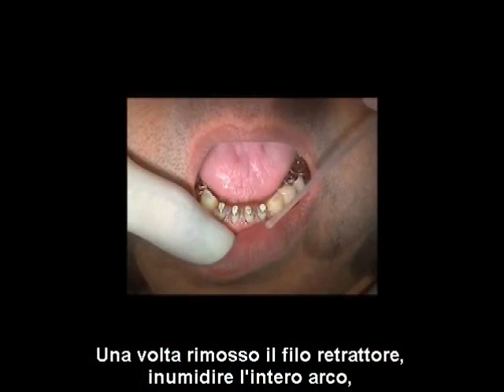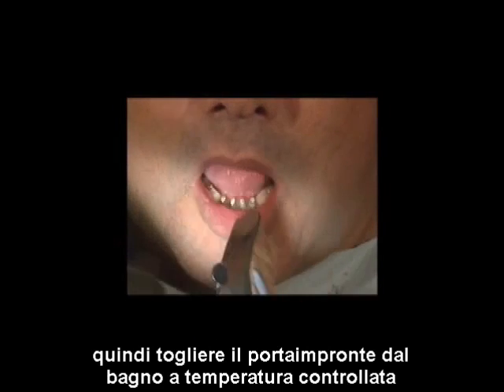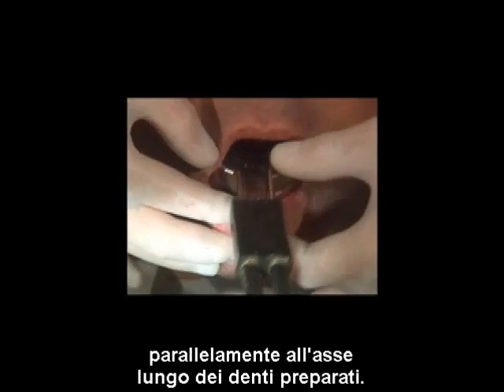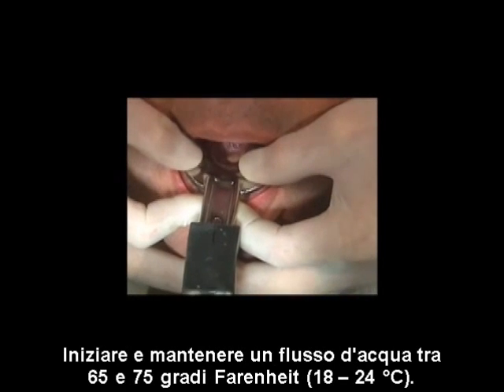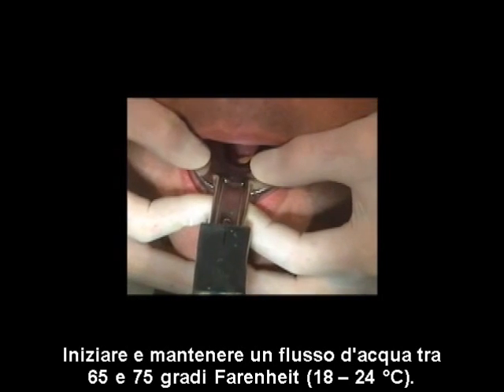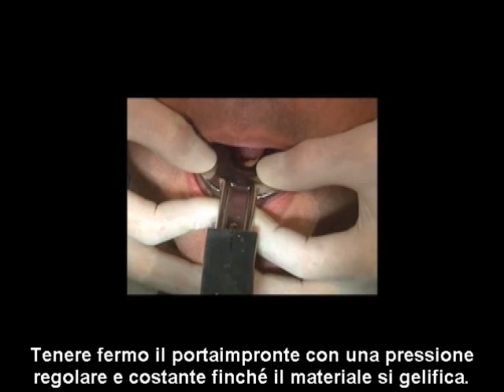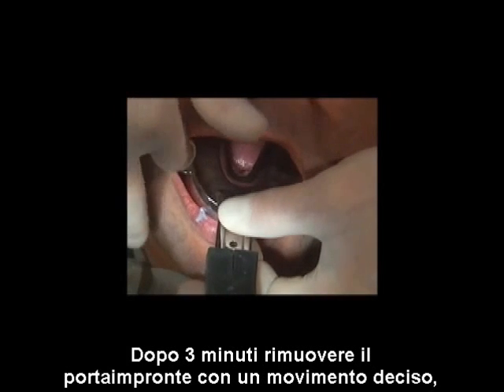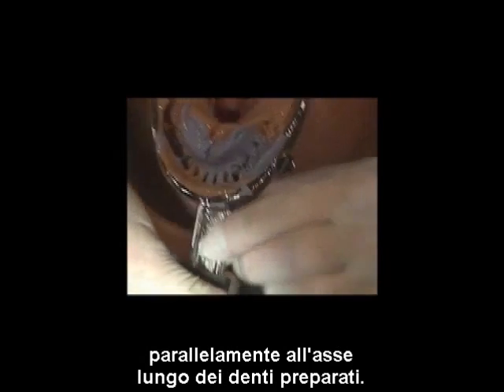Once the retraction cord is removed, wet the entire arch with PrepWet. Remove the tray from the tempering bath, attach the tubing, and seat the tray firmly and deliberately, parallel to the long axis of the prepared teeth. Initiate and maintain a 65 to 75 degree Fahrenheit flow of water. Hold the tray with steady, even pressure while the material gels. After three minutes, remove the tray with a deliberate snap, parallel to the long axis of the prepared teeth.